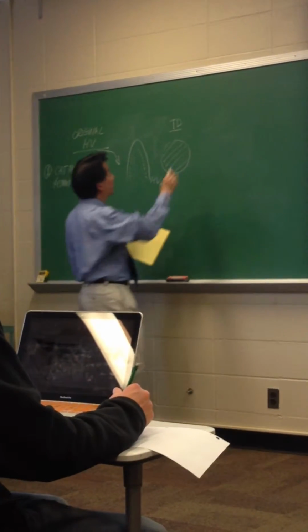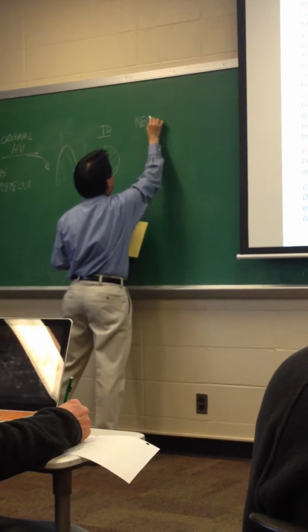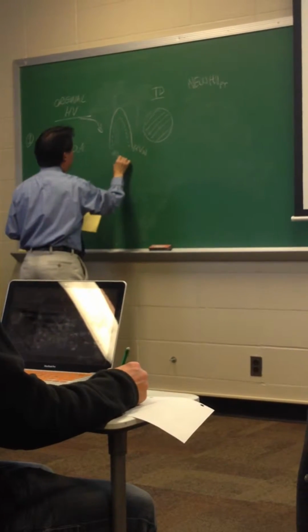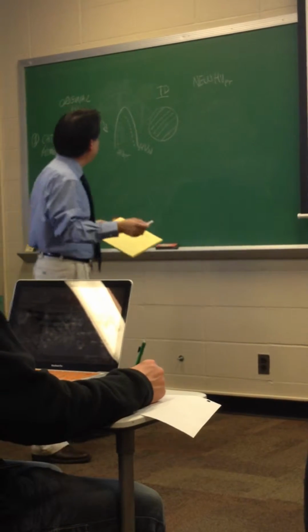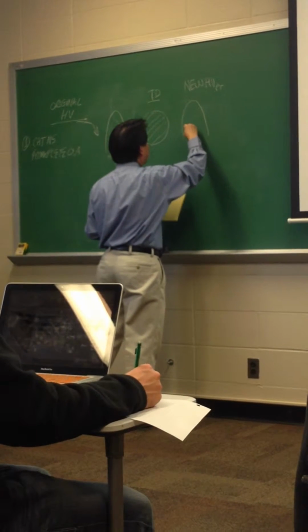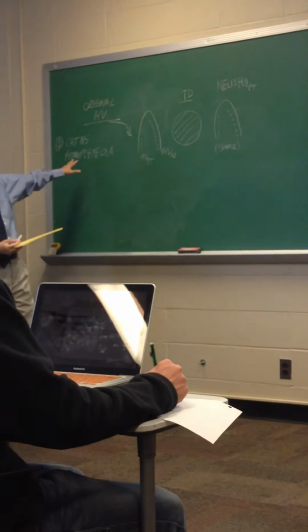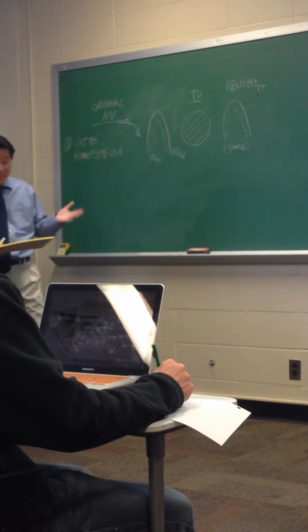So what the pattern deviation does is it calculates a mean, and this would be the patient. It calculates the mean sensitivity across the field. For this nuclear sclerotic cataract or incomplete optic atrophy, it's the same because it's uniform.